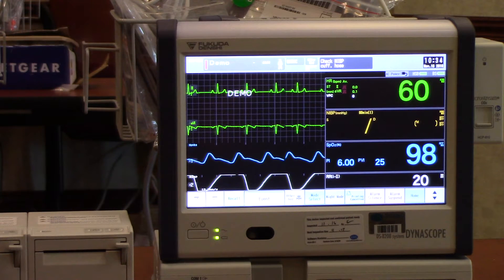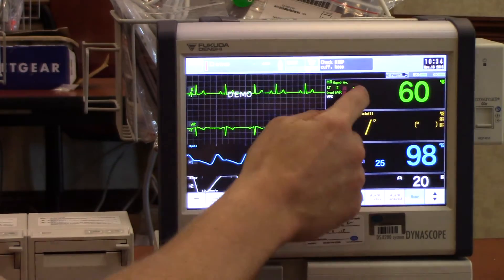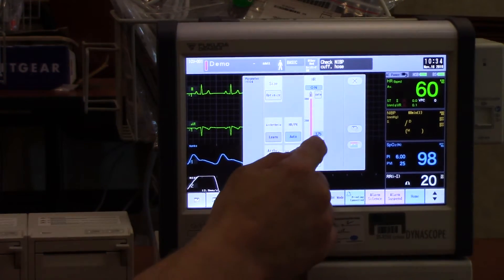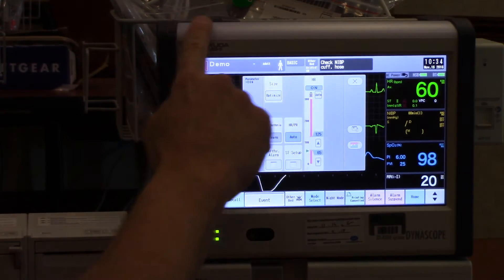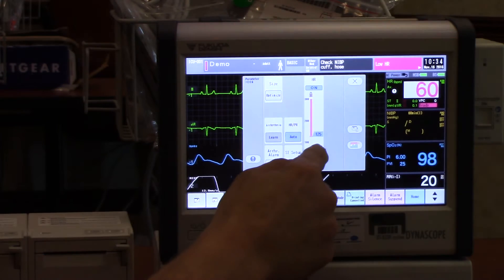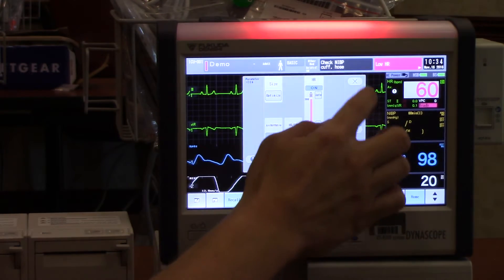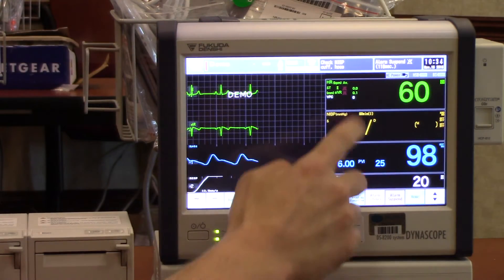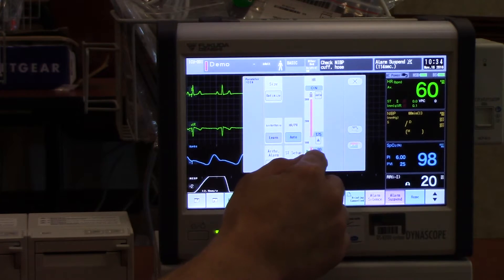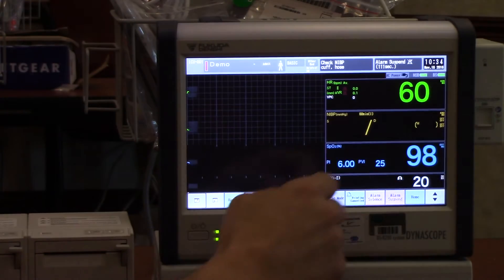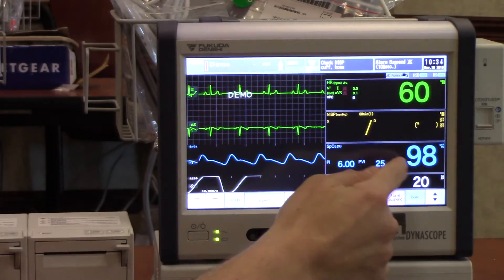I'm going to briefly go over the alarm settings for your bedside monitors. For your heart rate alarm, this will be the tone and light associated with it. You have the more continuous alert along with the red light at the top of your light bar.